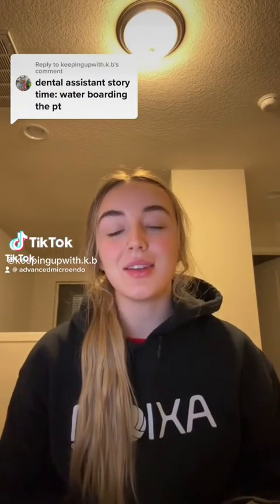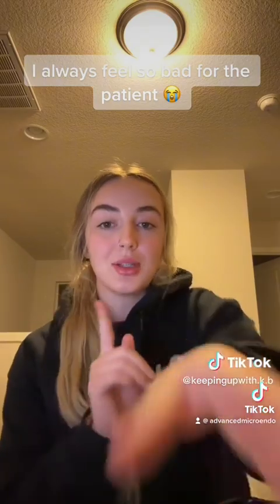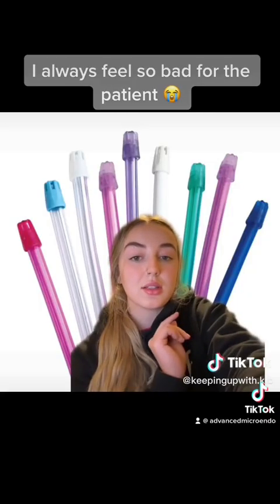Okay, here is another dental assisting story time. For the people who aren't dental assistants, I'm gonna show you a little bit. We have two different suctions that we use: a saliva ejector and an HVE, and they have totally different powers. Let me show you. These are saliva ejectors.